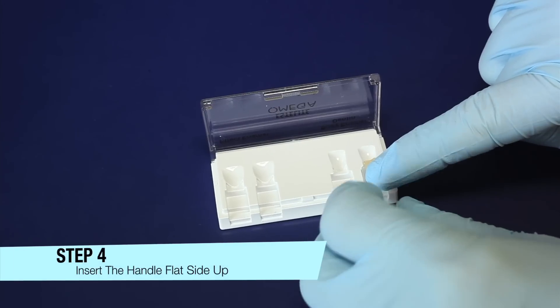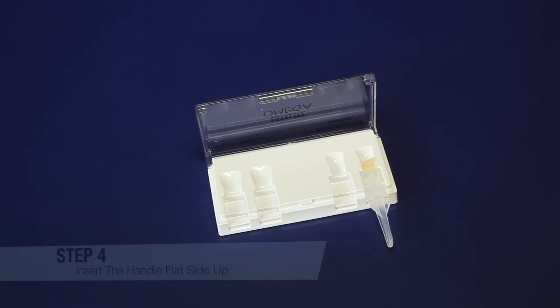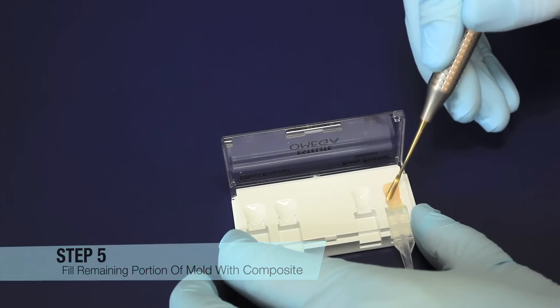Step 4: Insert the handle with its flat side up until it seats completely and is flush with the mold surface. Step 5: Fill the remaining portion of the tooth mold with composite. Be sure not to overfill.